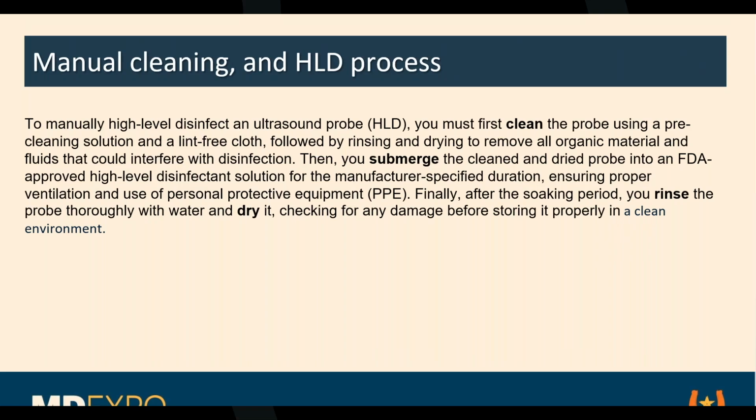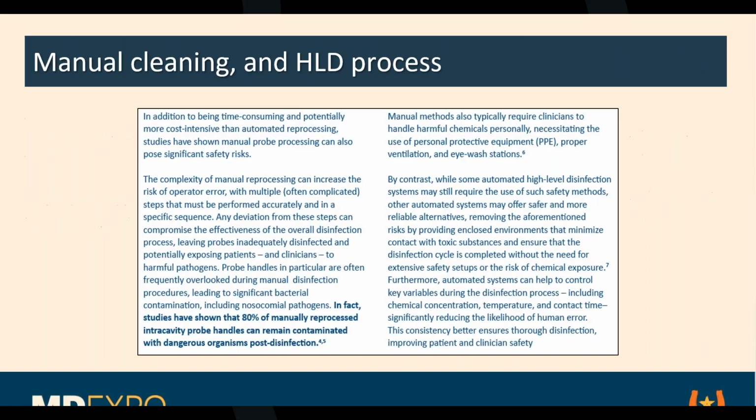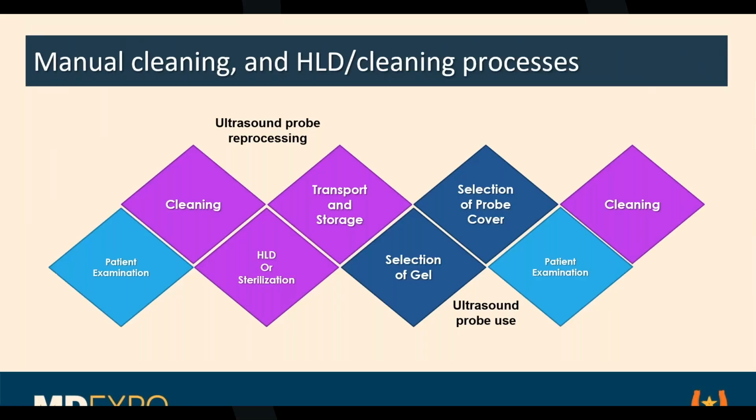Because they still work during COVID. They don't go home. So it's good to have those, and all of them have this manual cleaning process. There are all kinds of issues related to it, but there are still a lot of hospitals that either do it manually, do it automated, or have a hybrid for the probes, depending on what their use is.